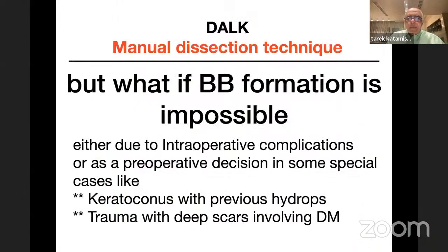big bubble. But what if the big bubble formation is impossible, either due to intraoperative complications or as a preoperative decision in some special cases in which we decide not to inject air, like keratoconus with previous hydrops, or trauma cases with deep scars involving the DM? So in these situations, we have to learn the manual DALK technique.